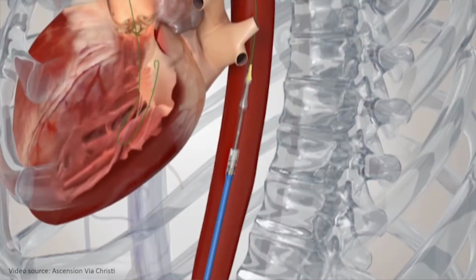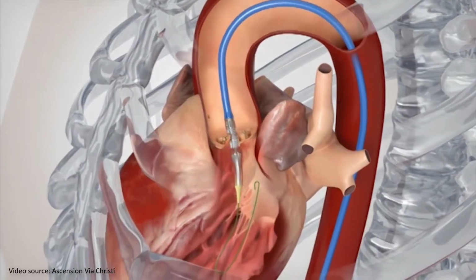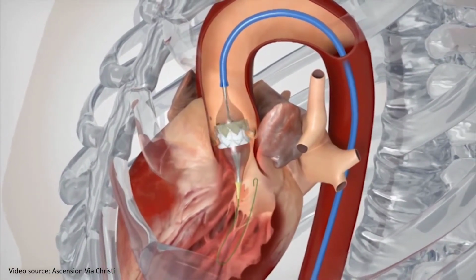We work in the context of transcatheter aortic valve replacement, which is a minimally invasive procedure introduced in 2002 to treat aortic stenosis in high surgical risk patients. In transcatheter aortic valve replacement, you would receive a bioprosthetic valve, which is delivered using a catheter like this.